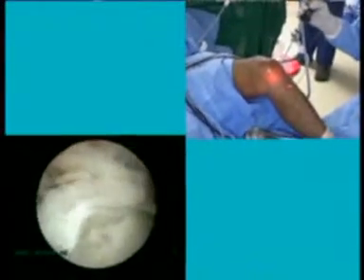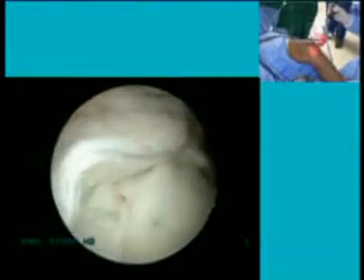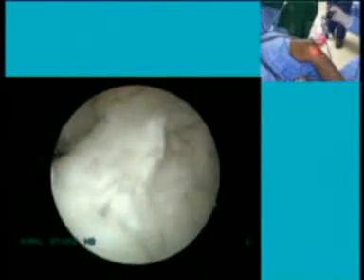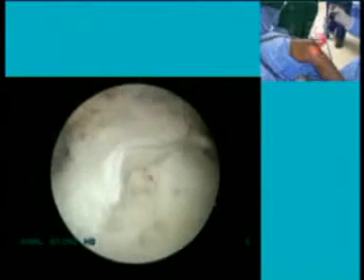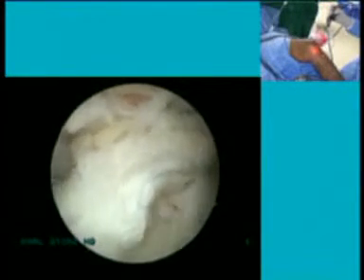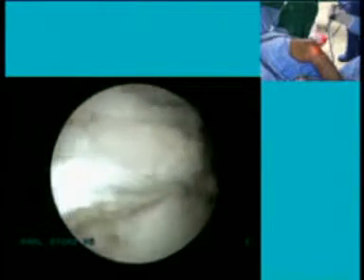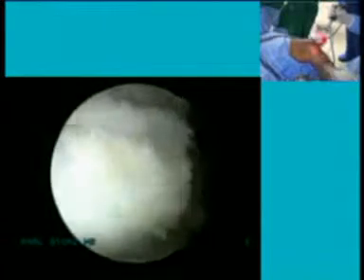Then give me the tibial guide, please. Do you like to remove the tibial stump before proceeding, or are you happy to proceed? No, I'm happy to leave as much old ACL tissue intact as possible. Then I need the drill guide again.